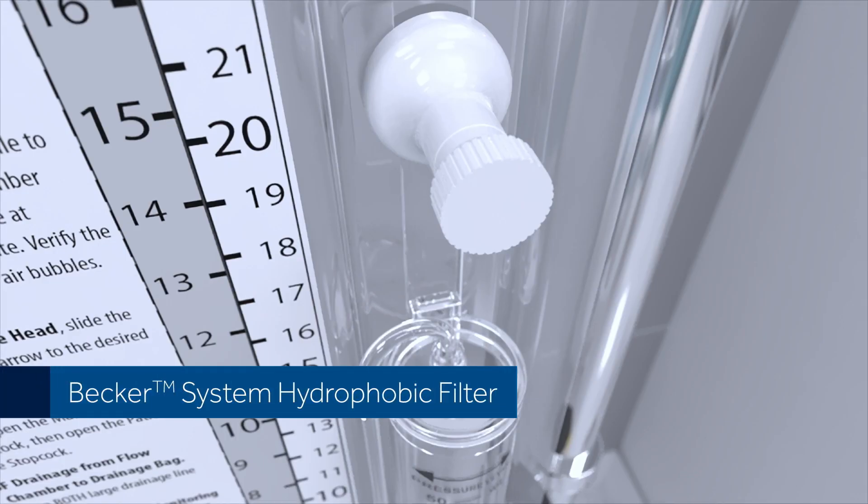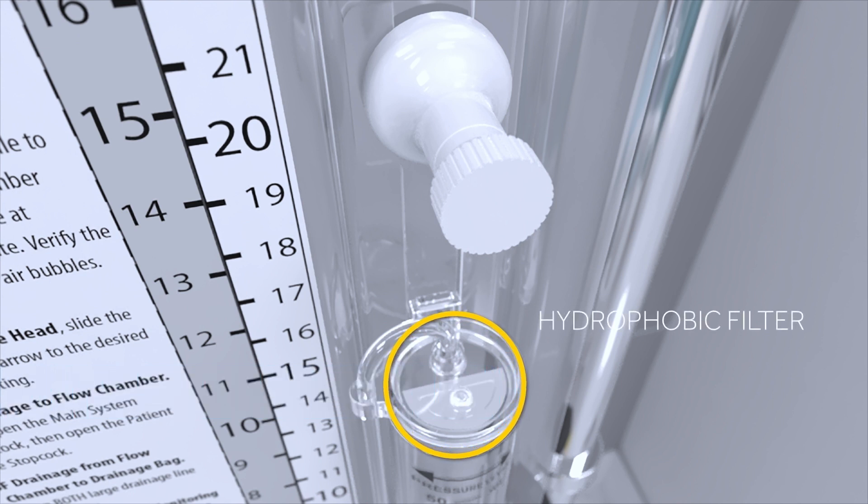Becker System Hydrophobic Filter. The Becker system is equipped with a hydrophobic filter at the top of the drip chamber, which is designed not to clog if it comes in contact with fluid.